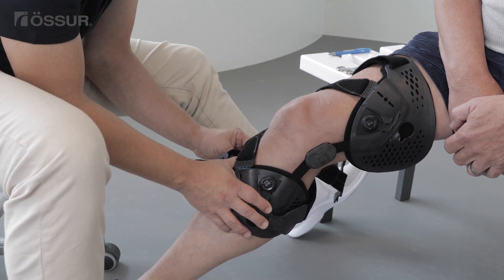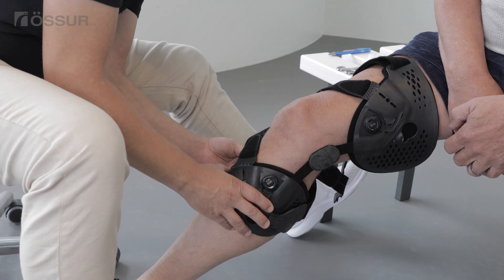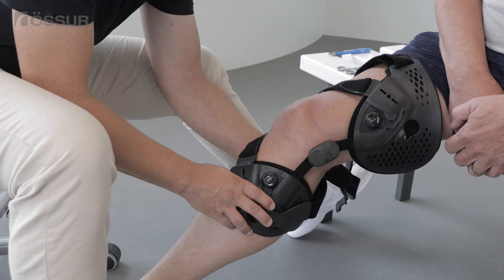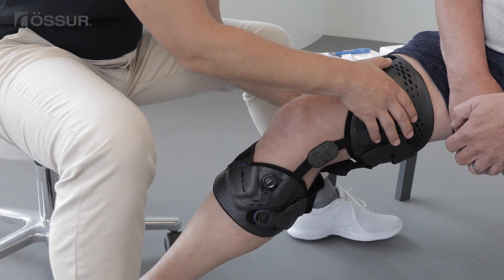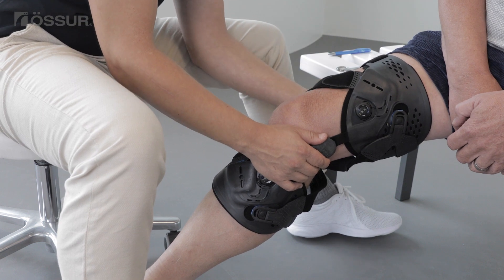Position the calf strap above the widest part of the calf muscle. Use the alligator clip to get an appropriately snug fit. Place the button of the yellow quick fit buckle into the yellow keyhole and close. Use the alligator clip to get an appropriately snug fit of the thigh strap.